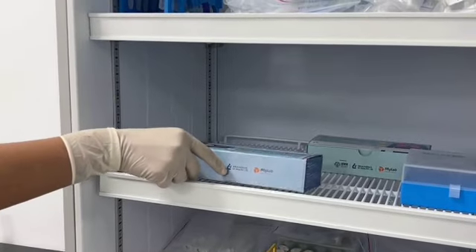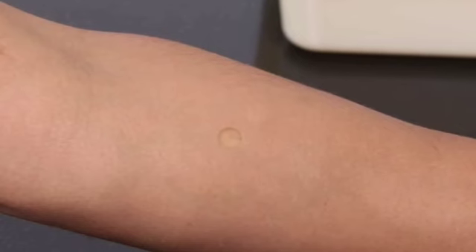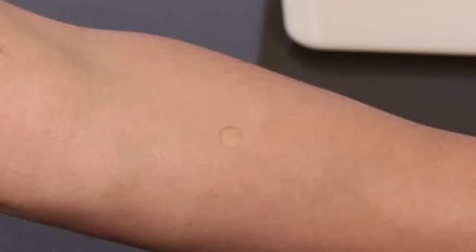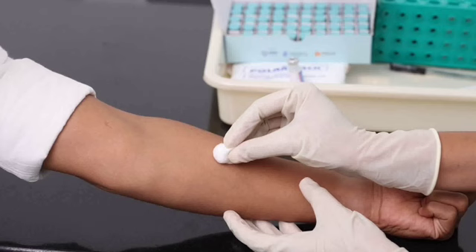Return the vial to the refrigerator after administering the solution. If the papule is not formed, repeat the injection at least 2 inches away from the first site on the same arm or on the other forearm.